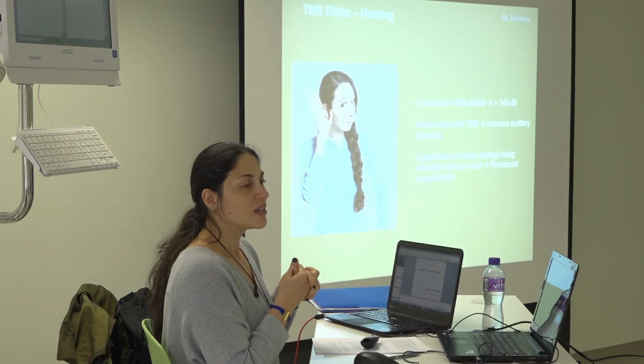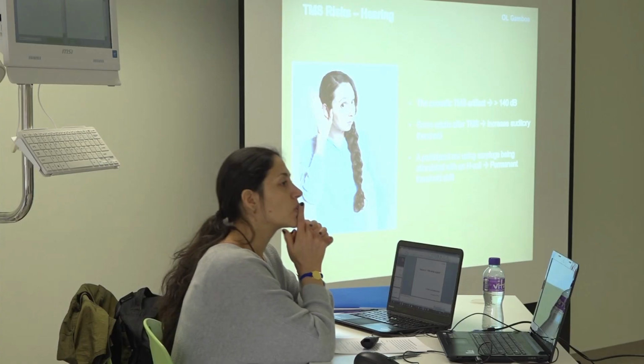And I asked, what if they don't want to use it? Then you don't measure. Okay? I want to ask a question. Is any earplug okay for them, or is there a specific one? No, earplugs, the ones that you put inside and then they expand.